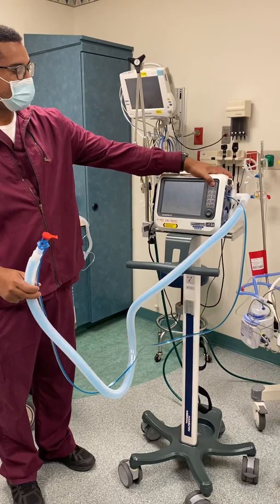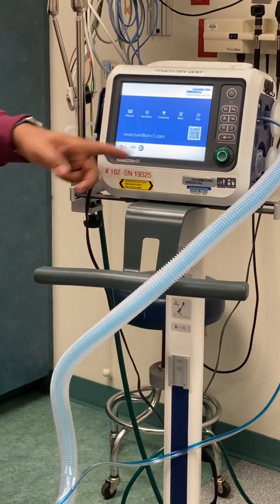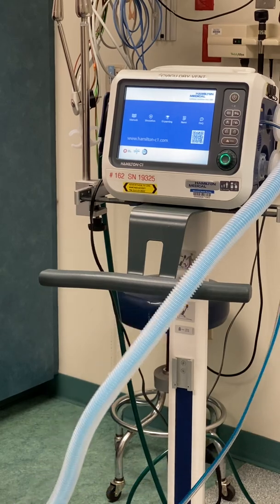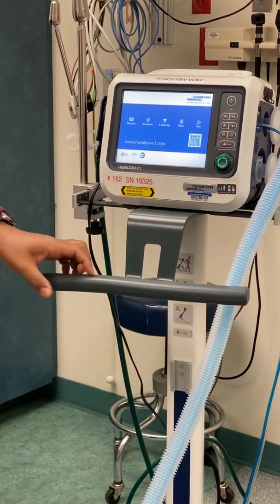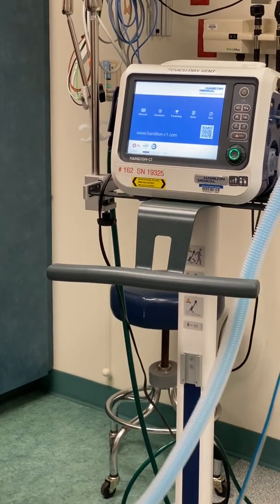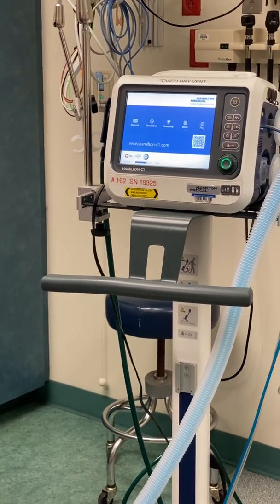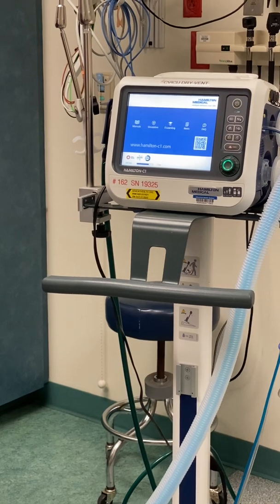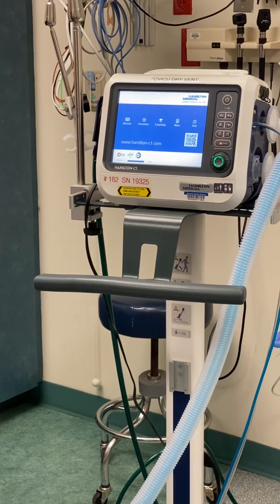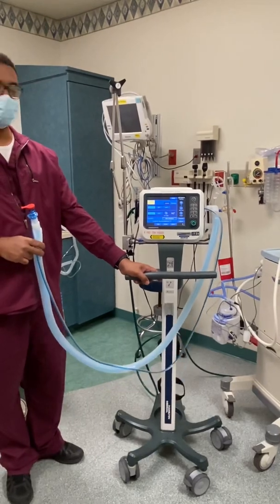I'm going to go ahead and push the power button for startup. Wait 30 seconds at the bottom for the self-check to complete. The self-check will take a little time. Self-check is complete.